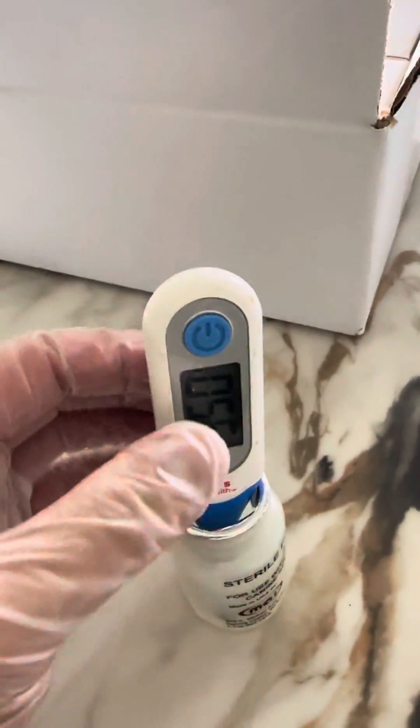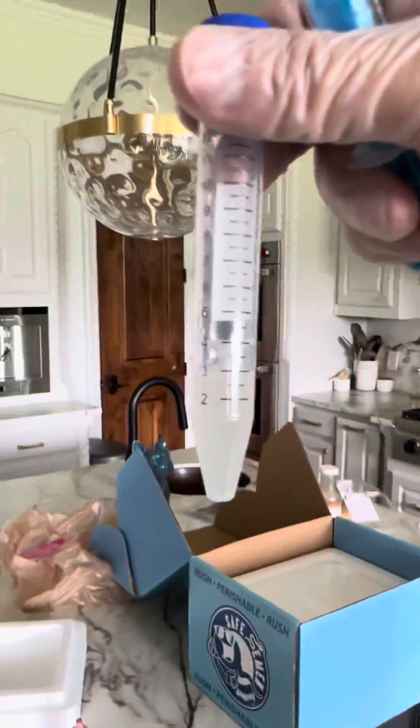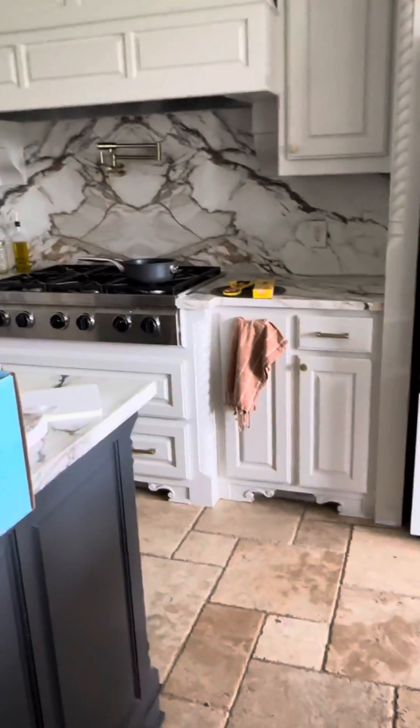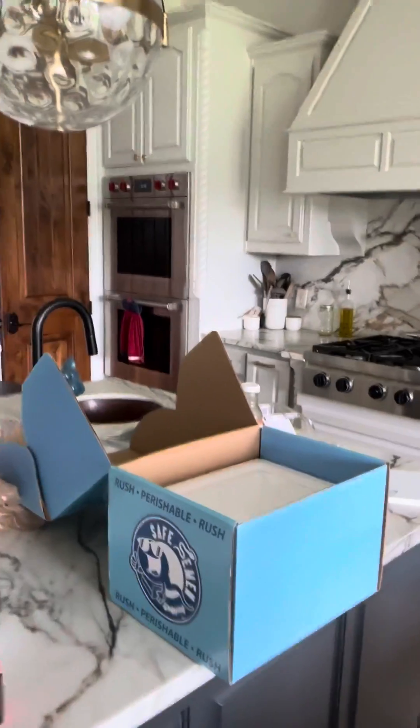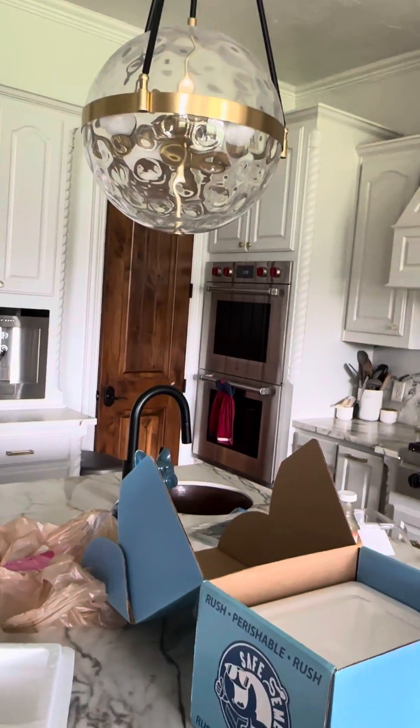I'm going to go ahead and mix my extender. I do one-to-one, so if there's 3 cc's of semen, I do 3 cc's of extender. As you can see, I've got 3 cc's of semen. I always put it in on the side, not directly on it, but I don't think it matters much.